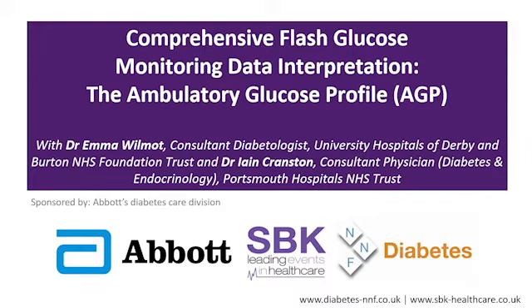Yeah, I think that is a really good way of looking at it, actually. And you're right, reflecting back, when you get handed the blood glucose diary, your eye goes to the 22 rather than looking at the fact that the majority of them might be 6 to 8, for example. And obviously, when you look at the data that we've got the AGP, but we've also got the time in range. How do you use those two metrics together in terms of your decision making when you're speaking?